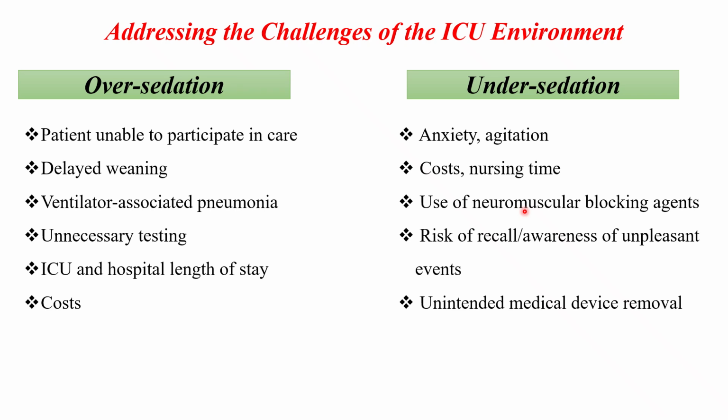Agitated patients need intensive monitoring and intervention, and use of neuromuscular blocking agents. These are sometimes employed to manage agitation caused by under sedation, but they have their own risks. There is also the risk of recall, awareness of unpleasant events, and unintended medical device removal.